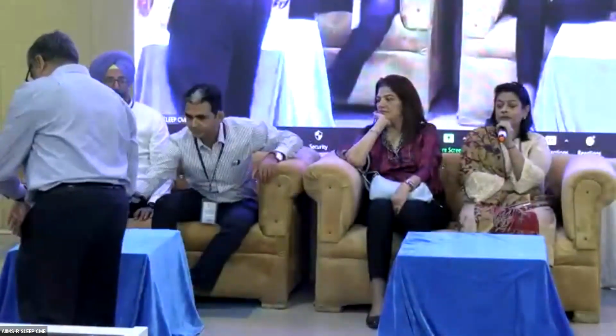We also have a lot of co-sleeping bed partners. Even elderly or middle-aged people are in congested environments where the houses are small. They would be two or three sometimes. So is there a movement of the device? Is there sweat which affects the recording? And also we need to compare it with what happens in patients when they are managed. Ultimately, after the diagnosis, you will have to do a titration study also. So I think it's a very good device for screening.